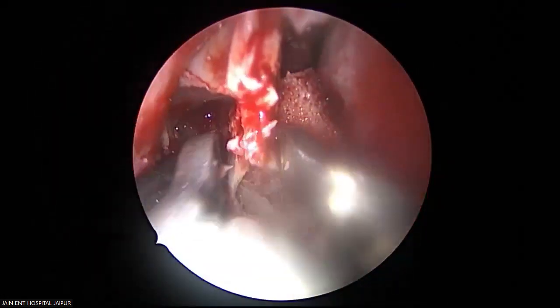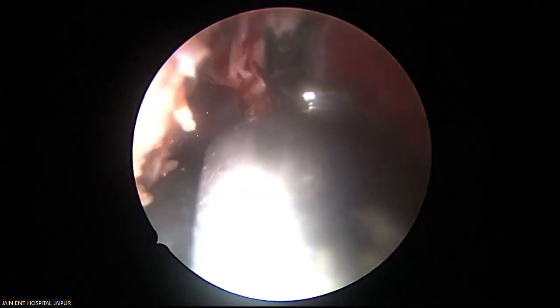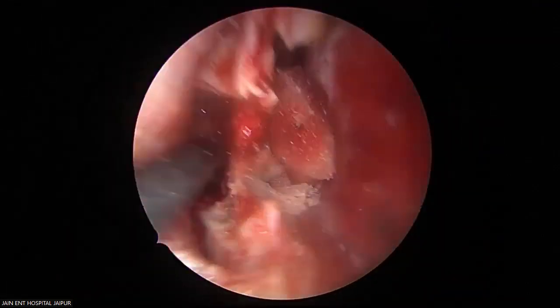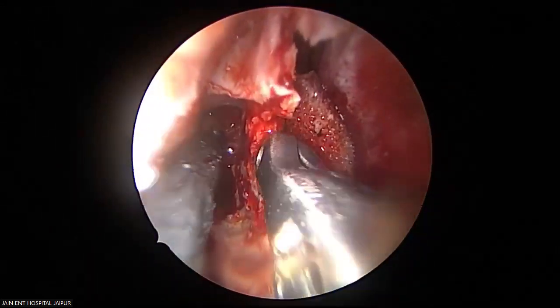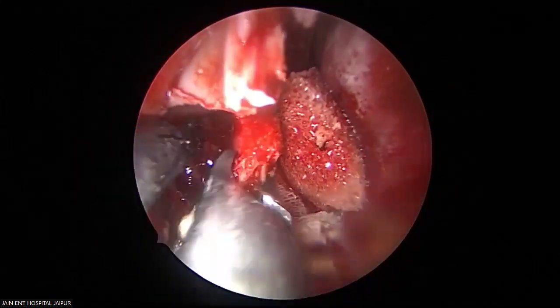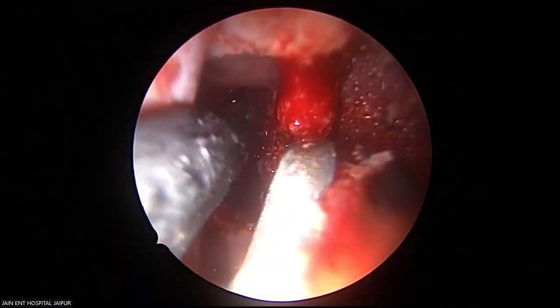Behind and up is the nasolacrimal duct. This is your nasolacrimal duct there. The lower part I can remove. The duct is above.